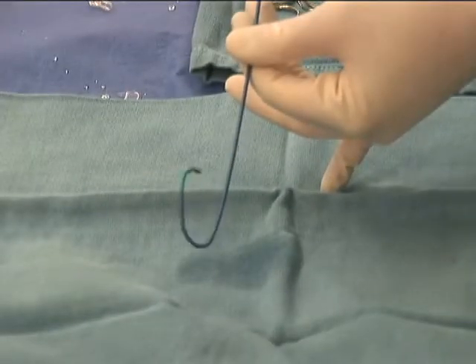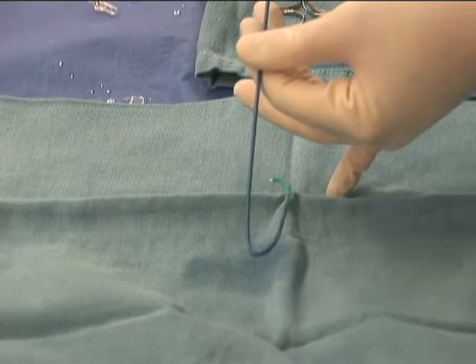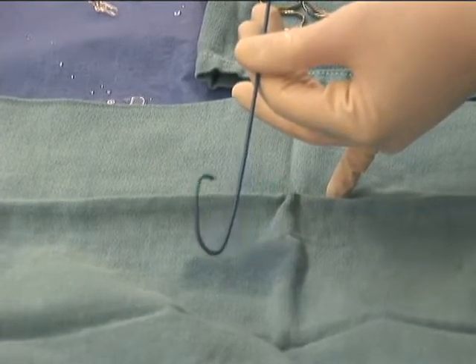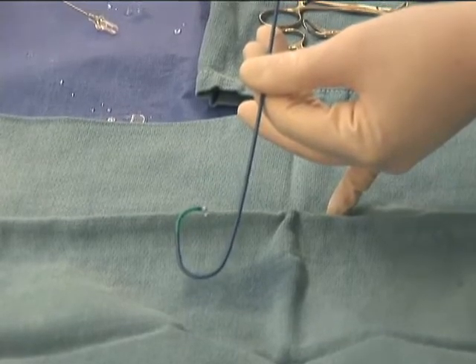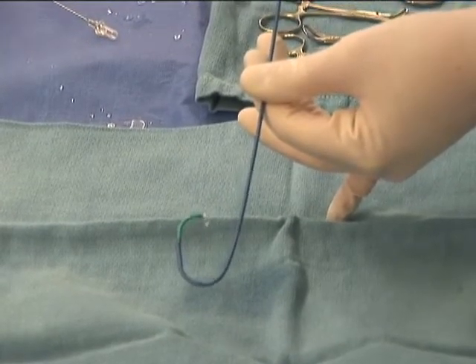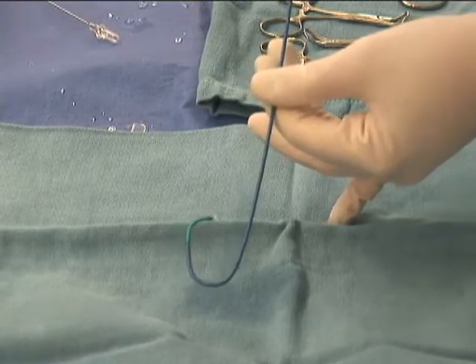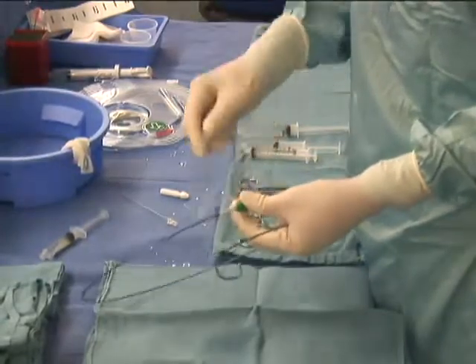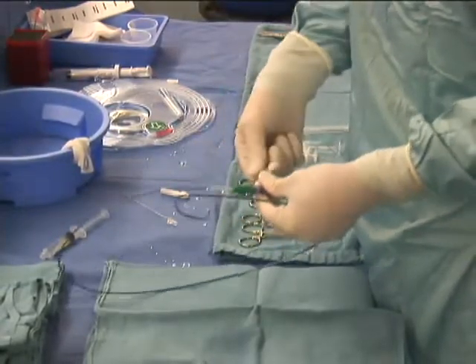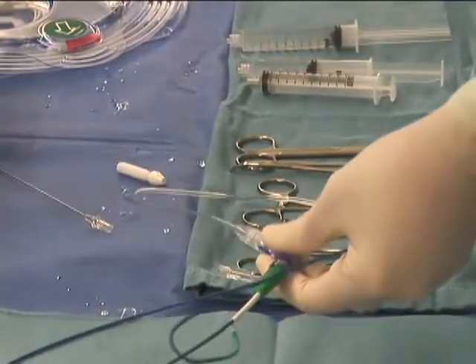In this example, a 6 French JL4 guiding catheter will be used to cannulate the left coronary artery in preparation for IVUS. Various anatomic factors such as lesion location and tortuosity play critical roles in the choice of guide catheter curves. Also seen here is a type of hemostatic adapter through which interventional equipment such as wires and balloon catheters are advanced into the coronary artery.